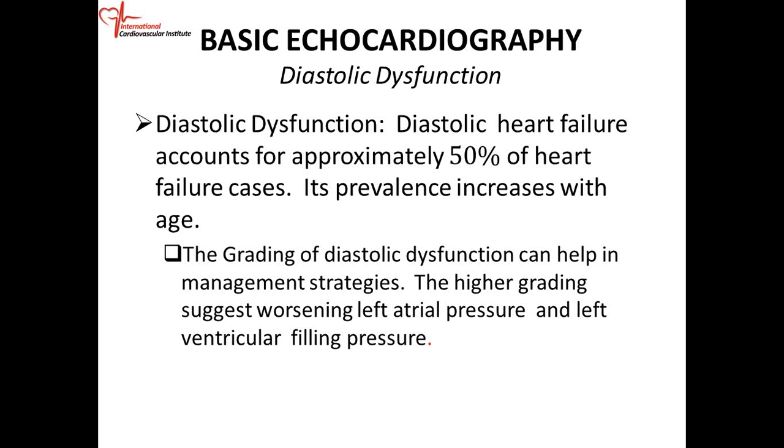So the grading of diastolic dysfunction can help in the management strategies, how you treat the patient. So if you can grade it, then you can affect management by tailoring the treatment to the level of diastolic dysfunction. So the higher grading suggests worsening of left atrial pressure and the left ventricular filling pressure, as we said. So we have a 4 grading system.